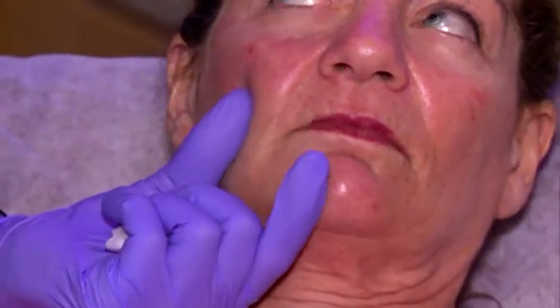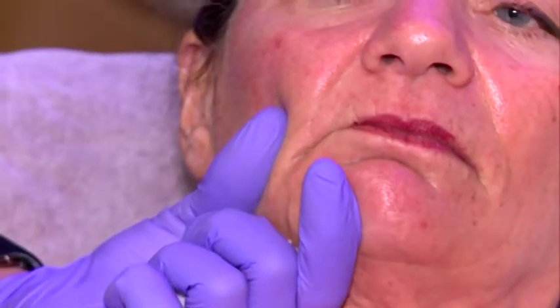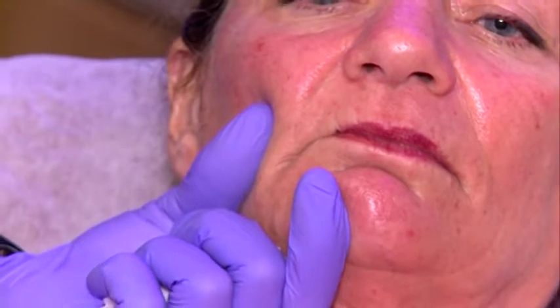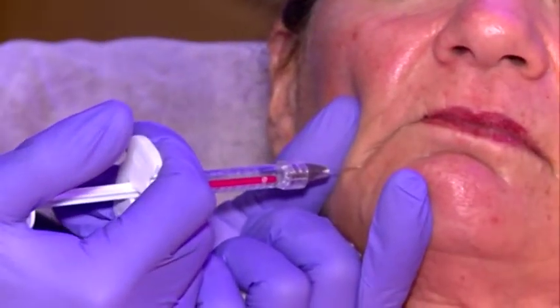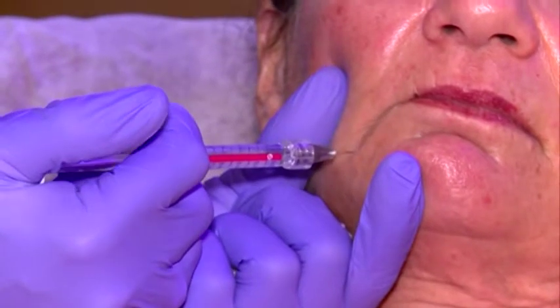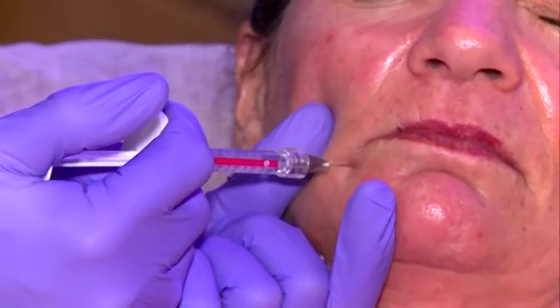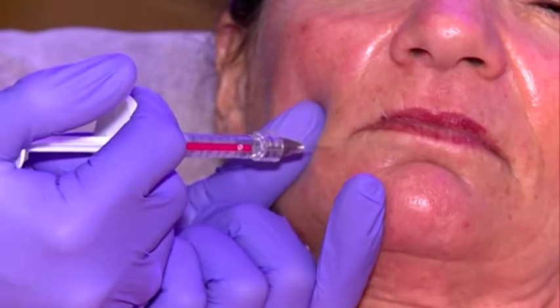Okay, what I do, I pinch the skin. Can you see? I pinch the skin, and I'm subdermal, so I'm a very superficial injector of Belotero, because tissue integration is so excellent. And what I do in here, I just prick in here and do a tiny bolus of 0.1. She has no numbing cream on it, but there's lidocaine in.